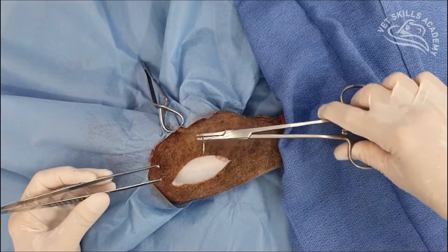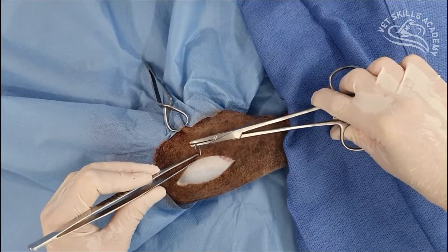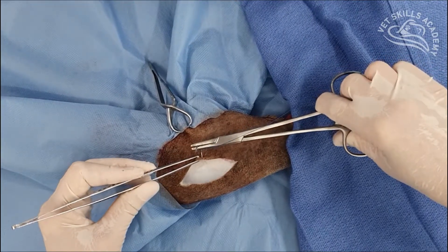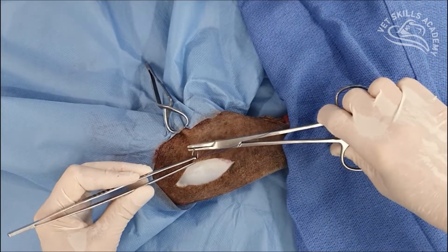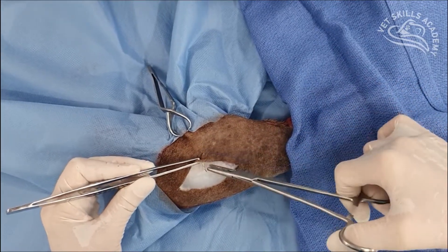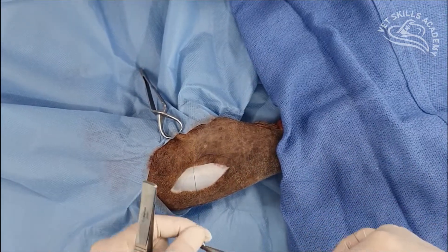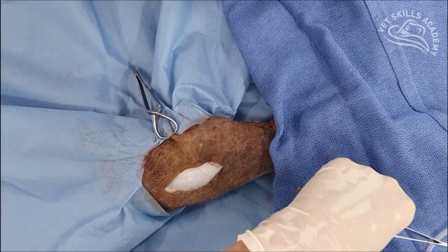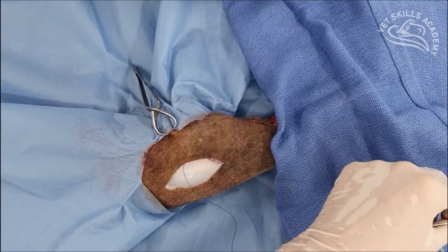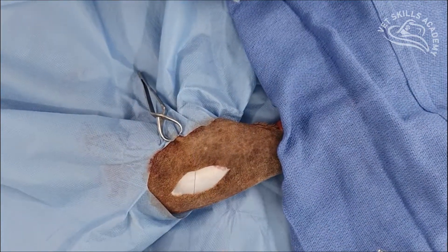For a near-far, far-near, the suture pattern goes as per the name. Taking the first bite is near. I would normally use a cutting needle — this is just a donated out-of-date suture for the purpose of the demonstration. Okay, so we've gone near.